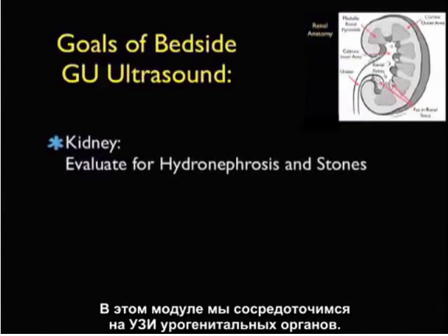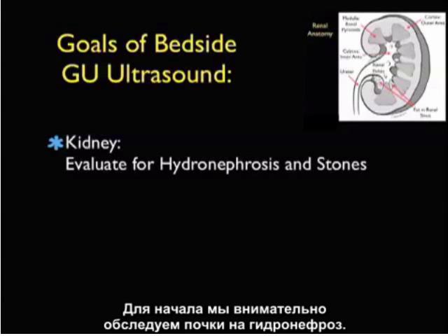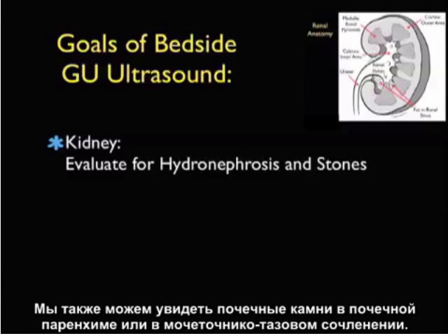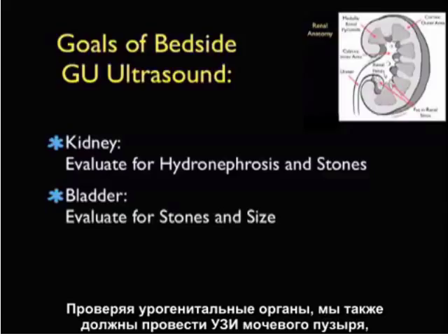In this module, we're going to focus on genitourinary ultrasound. So what are the goals of bedside GU ultrasound for the emergency physician? Well, first of all, we're going to inspect closely the kidney, looking for hydronephrosis. We may also be able to see kidney stones, as stones lodge within the parenchyma of the kidney or at the ureteropelvic junction.